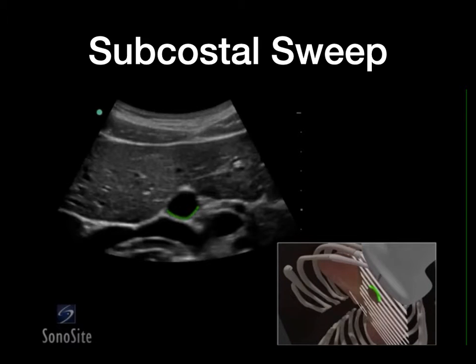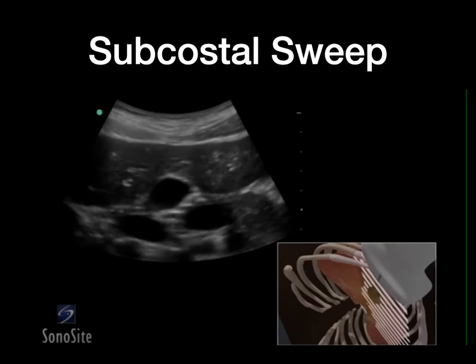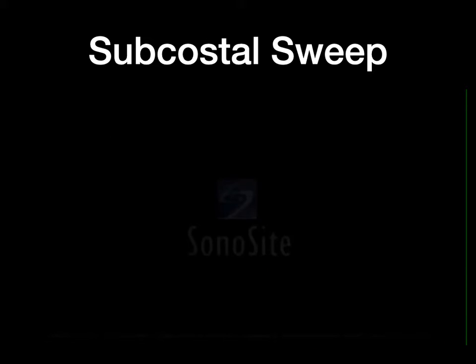Note that since the gallbladder is not a fixed structure, the longitudinal and transverse planes of the organ may not align with the longitudinal and transverse planes of the body perfectly. So once you identify the gallbladder in one plane, you may need to rotate clockwise or counterclockwise slightly to ensure that the gallbladder is its longest in the longitudinal and its most circular in the transverse.